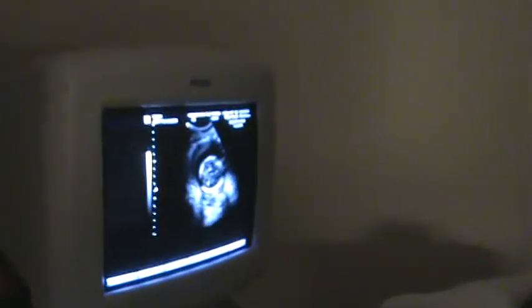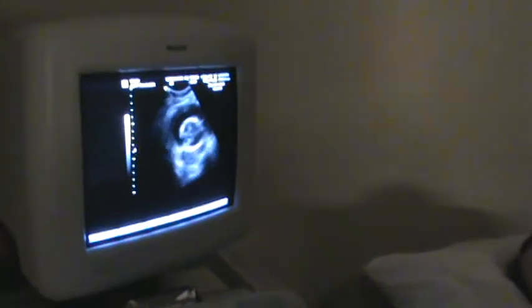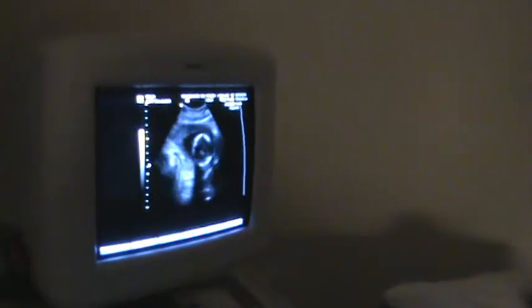Now here comes the brain anatomy. This is looking down on top of the baby's head. The white line is where the skull is. Baby just doesn't want to turn that head all the way, so I'm going to jiggle. He's like, you have no control over me, lady. Does that run in the family? Stubborn? Oh yeah. Come on — you just have to get the top of the head and baby just wants to give me the back of the head. Look at him. Or she. We will come back to that when we want to be a little more cooperative.